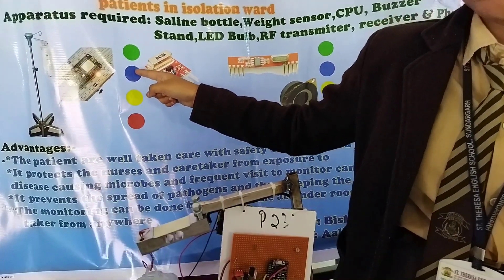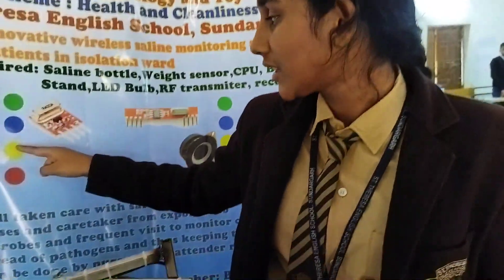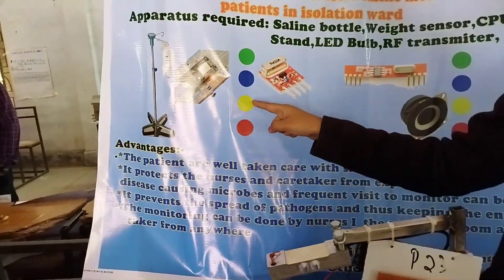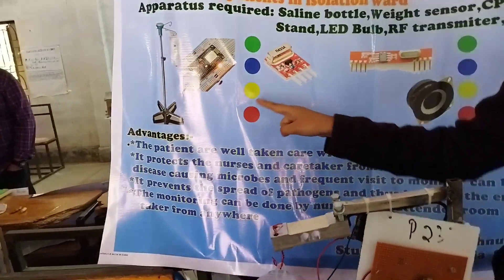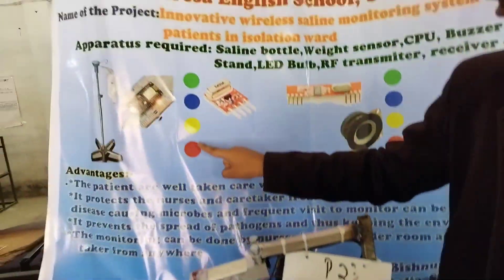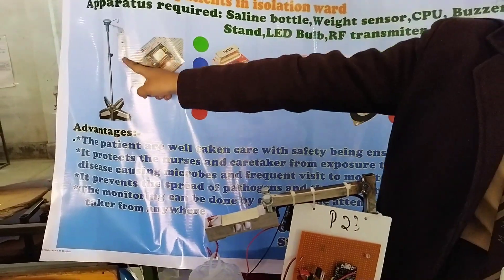This blue indicator indicates that it has 50% water. This red indicator indicates that it has 30% water.